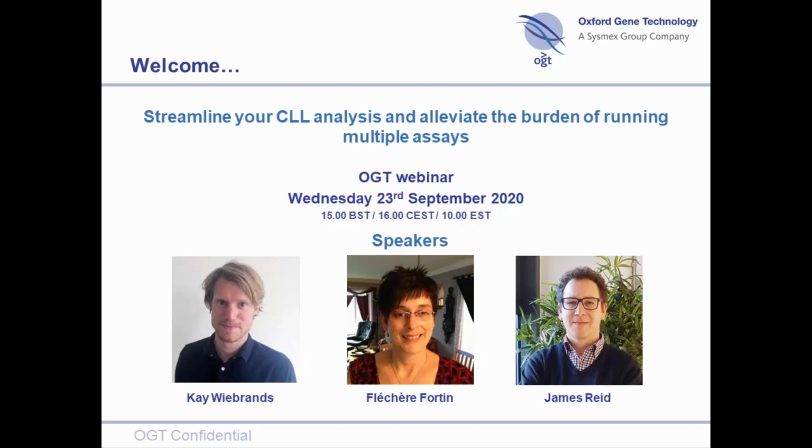We've been checking the question box this afternoon as a few questions have come in. First question, I presume probably for Kai actually. Kai, what's the actual detection limit for CNVs in terms of size? Yeah, thanks, Dave. So the CNV detection differs a bit per region. As you've heard just now, we detect these 5 different regions on 5 different chromosomes. We're targeting for CNVs, and within the genes, within these regions, we can basically detect CNVs down to the exon level or up to the whole gene.